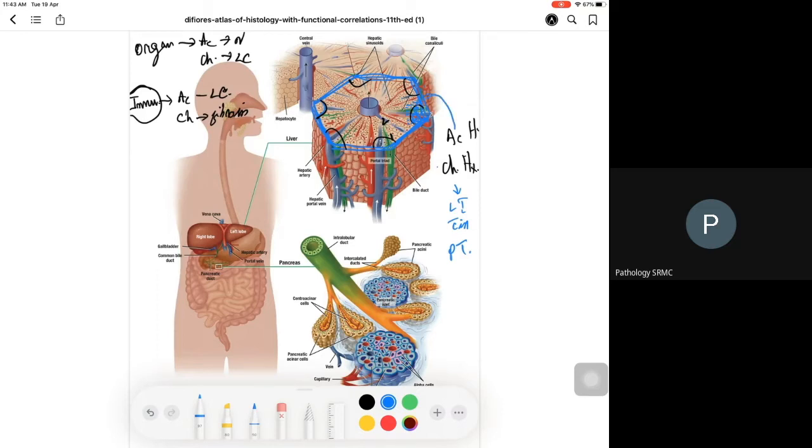So, in acute hepatitis, spillover, or the other terminology is interface hepatitis. It is present in between the junction of the portal triad and hepatocytes. Why am I paying attention? They may say the neutrophils coming out of the plate, portal triad plate, but there is no plate like that. The other terminology, a misnomer, is piecemeal necrosis. There is no piece, there is no meal, there is no necrosis. So that's why it's totally a misnomer, because you will read them in the textbooks.